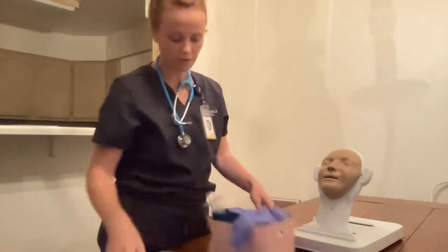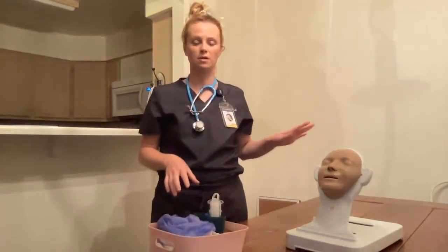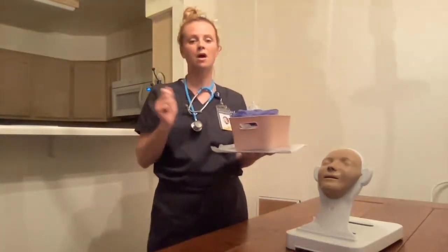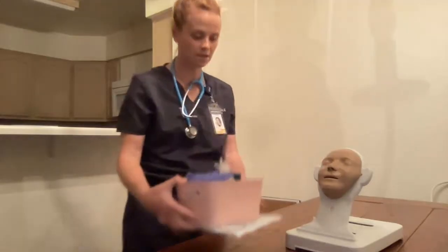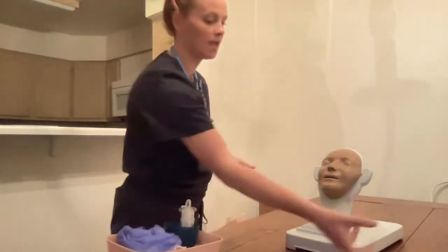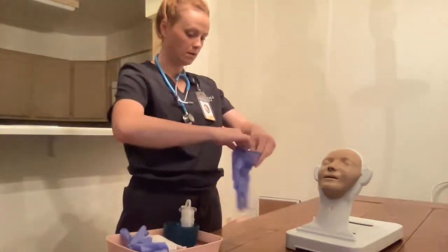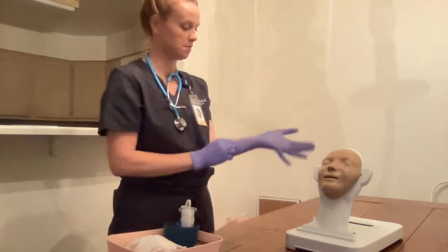If the physician ordered the patient to have suction set up, I will get the suction apparatus and tubing that goes with that. I'm going to gather my supplies, head to my patient's door, knock, enter, close the door behind me to ensure patient privacy, and set my supplies down on a clean, dry, flat surface. Hand hygiene. Gloves on, and introduce myself to the patient.